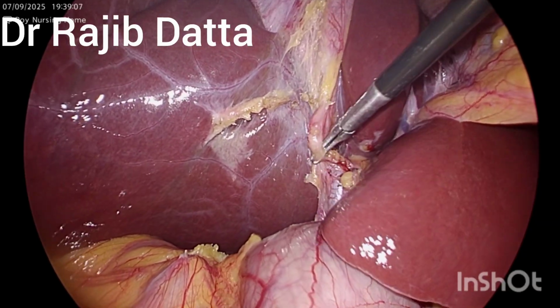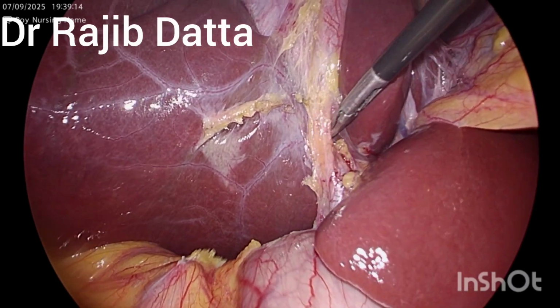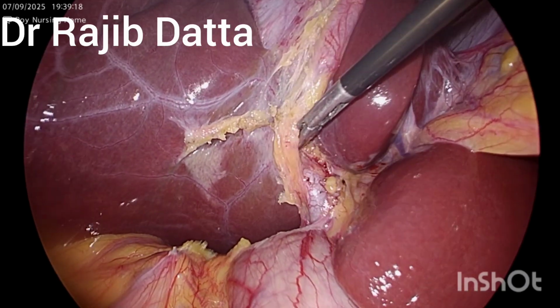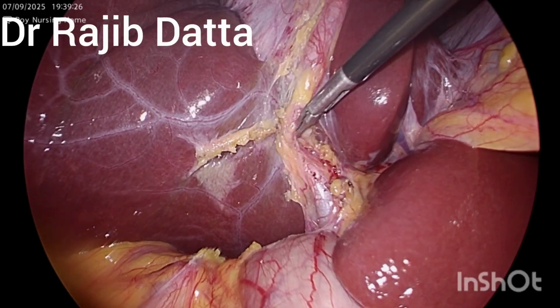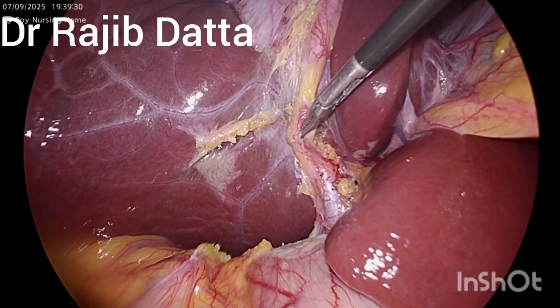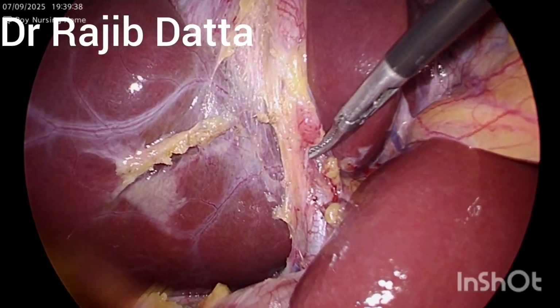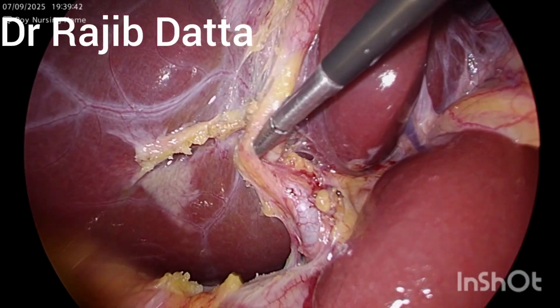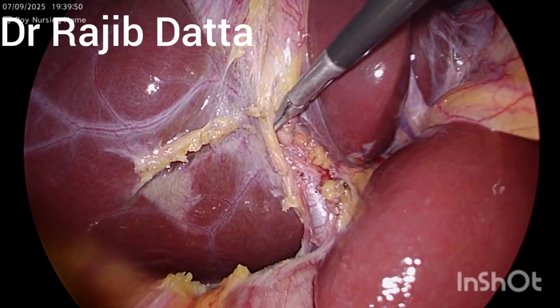So we are trying to separate the cystic artery and cystic duct, which should remain well away from the common bile duct so that injury towards the lateral wall of the common bile duct can be minimized and inadvertent clipping can be prevented.